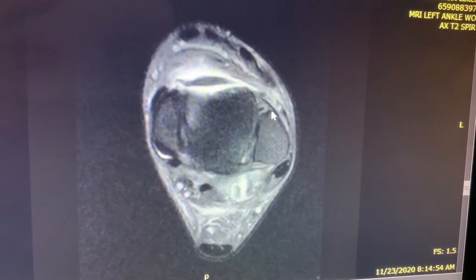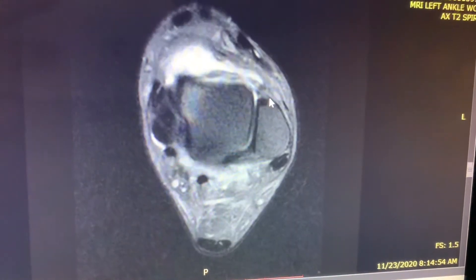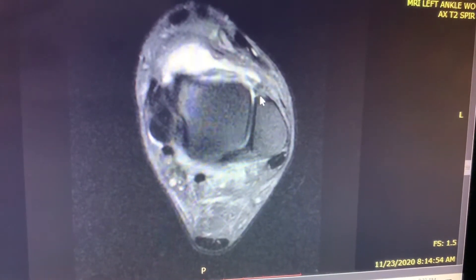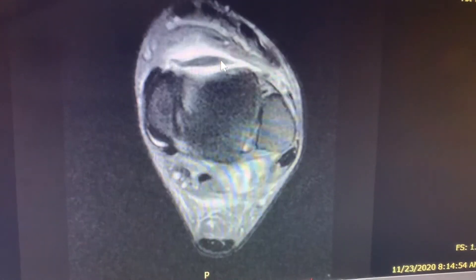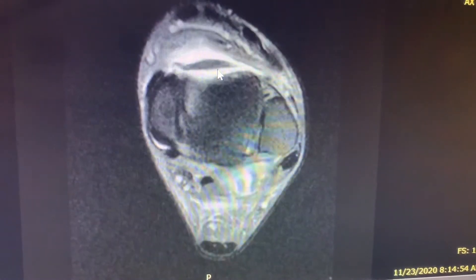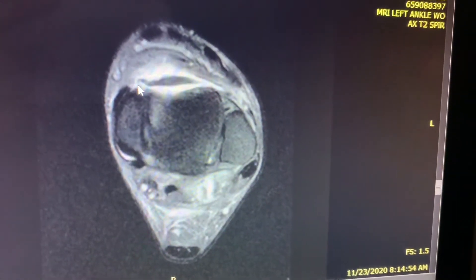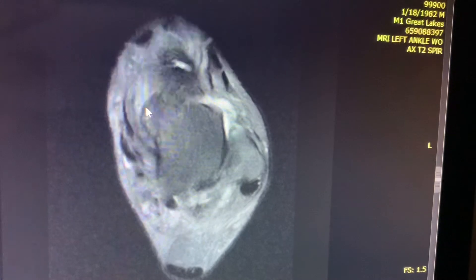These are the axial images, going from cranial to caudal. You can see this band-like structure arising from the lateral malleolus, just anterior and inferior to the ATFL. This is the ATFL. This band-like structure arises from the lateral malleolus, goes all the way across the talus and the ankle joint, and finally inserts onto the medial malleolus.